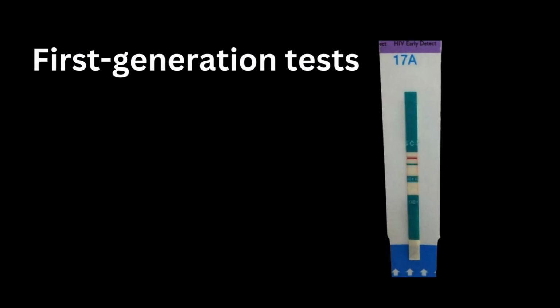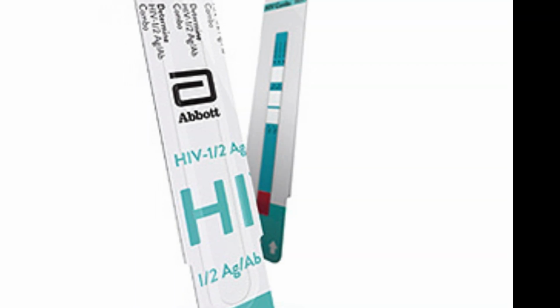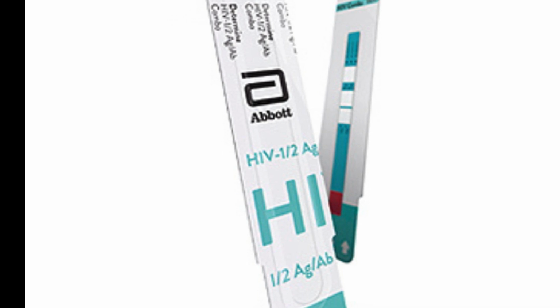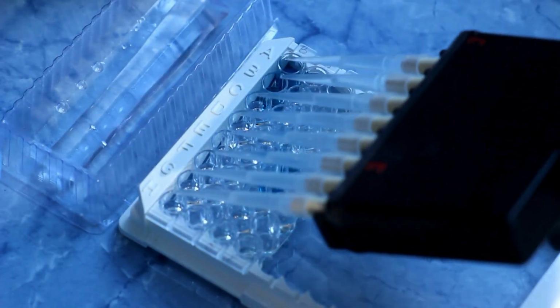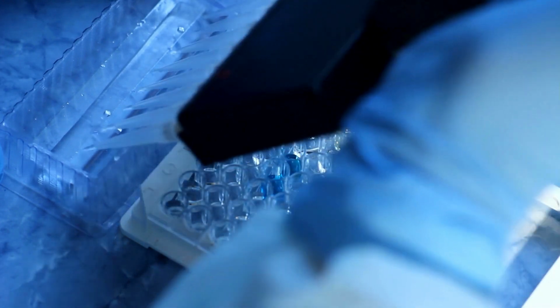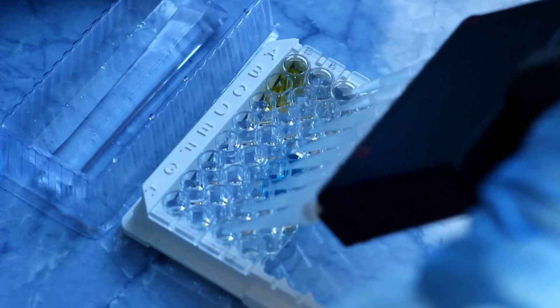Types of HIV test strips. 1. First-generation tests. These detect only HIV IgG antibodies. 2. Second-generation tests. These detect both IgG and IgM antibodies, reducing the window period. 3. Third-generation tests use sandwich techniques for higher sensitivity. 4. Fourth-generation tests can detect both HIV antibodies and the P24 antigen, further reducing the window period.